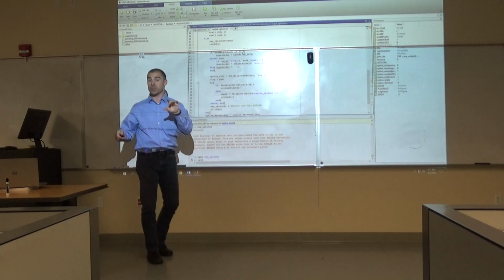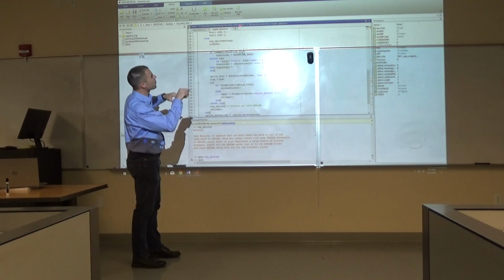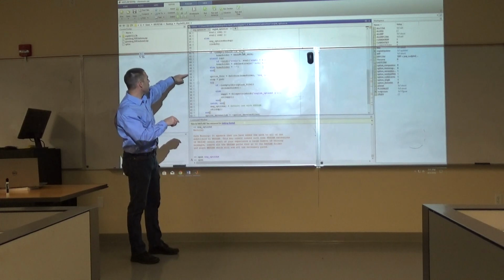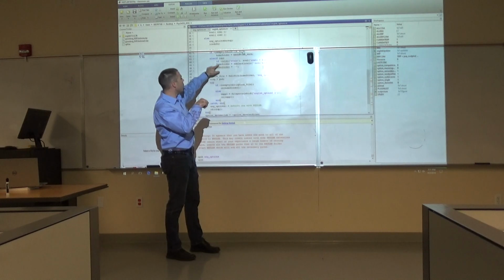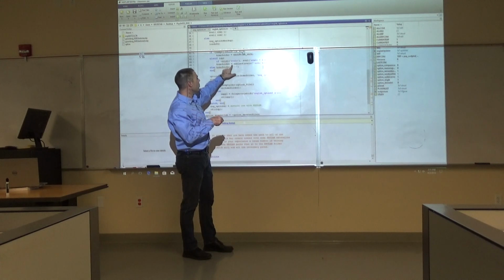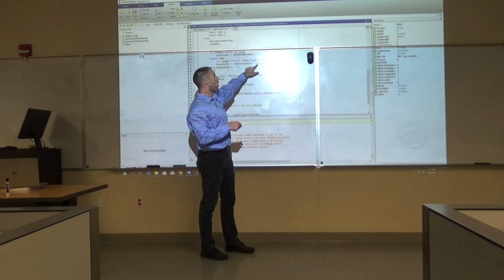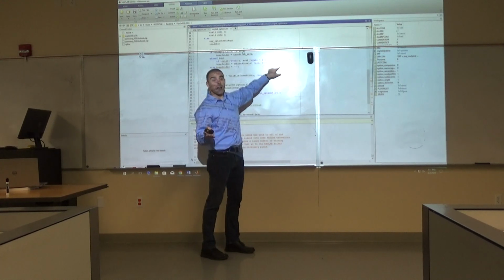So what I did is I went to that same file. This is what I'm going to show you now. This is kind of its path directory, and I'll walk you through it. It's essentially this EEG lab underscore options flow .m, and it's line 45. So it's here, and if you come over, it's looking for a home folder in its code, and it's asking what the home folder equals. For some reason, it has something on the user profile as its setting. I don't know what that reason is. That's okay for now, but we will set that to your setting.